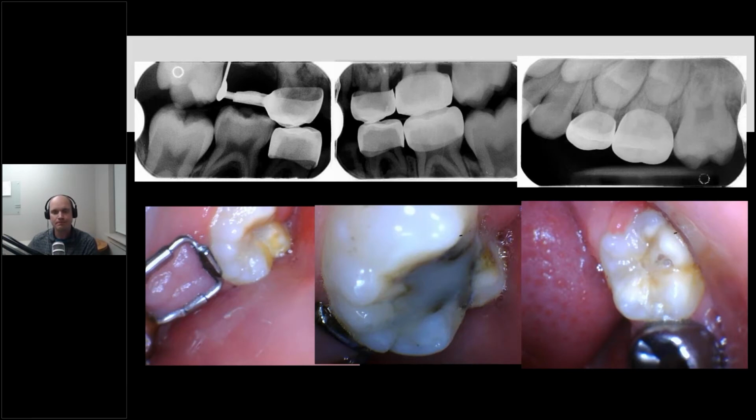For indirect pulp therapy, are you using calcium hydroxide or mostly Biodentine? No, mainly I'm using either a calcium silicate like Biodentine or Smart MTA or Neo MTA, as different products fit differently, or Riva Star. Definitely using those. I have shifted away from using calcium hydroxide. I don't see the advantage to using it from the studies.